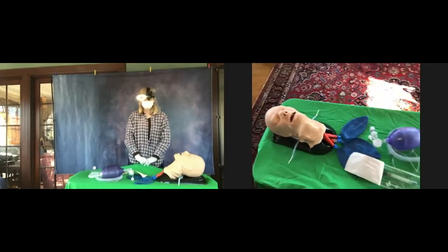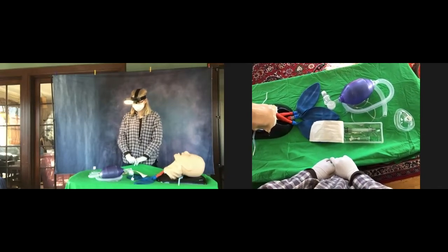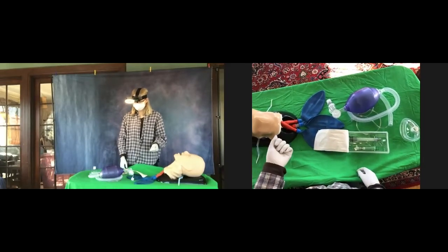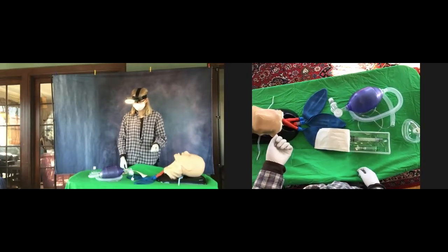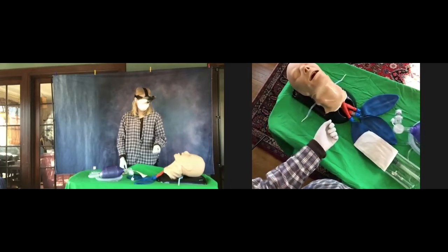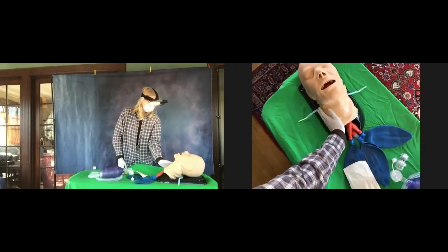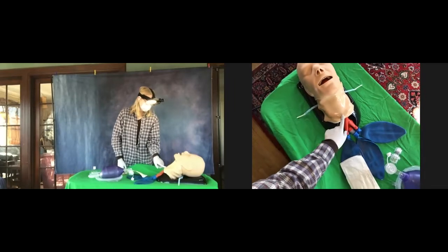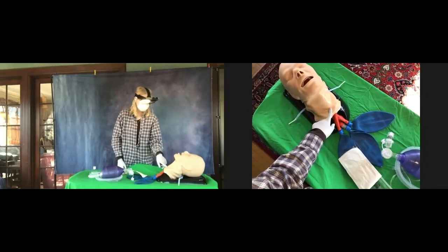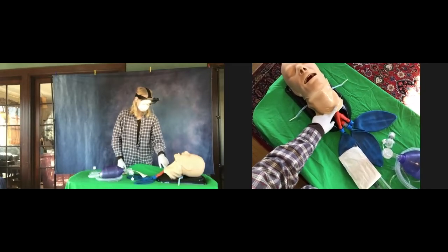Now you're going to take your left hand and put it right in the space on the neck, right where the collarbones come together. You can see it's just right at the very bottom of the neck. Put your pointer finger right there. Now slide up slowly in the middle — you're going to feel a bump, then a soft spot, and then a big bump.